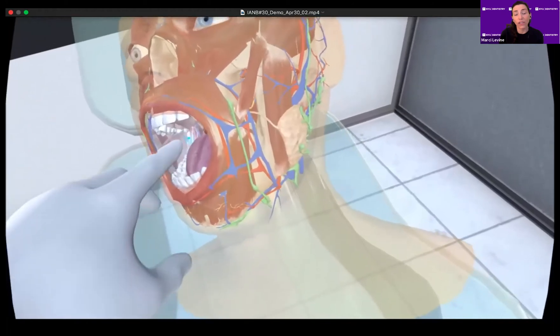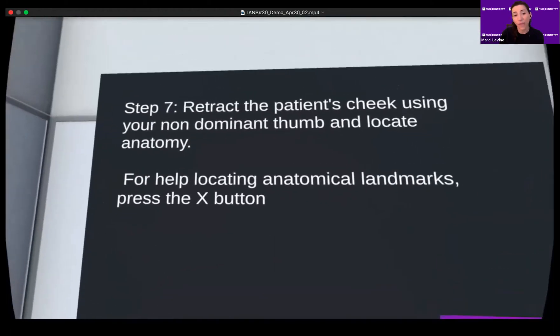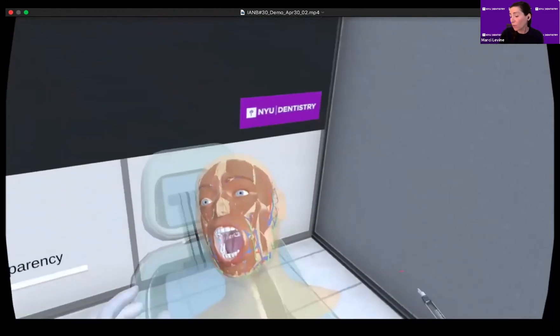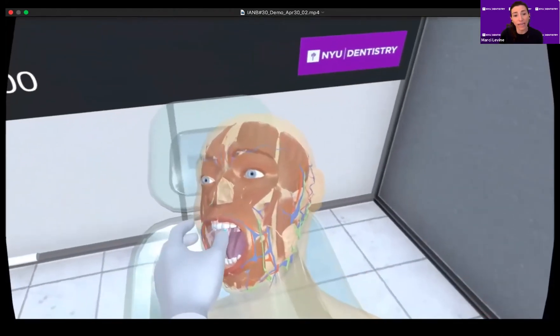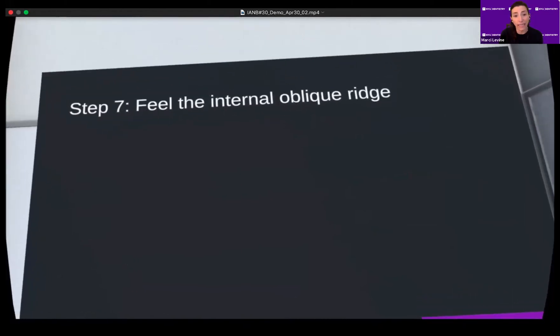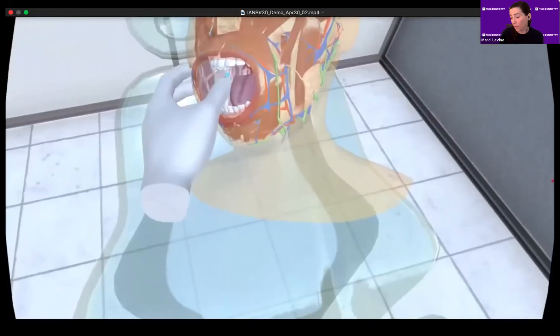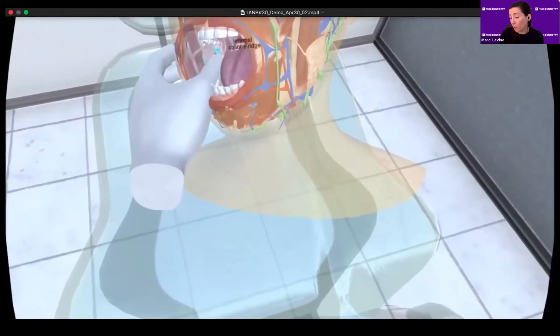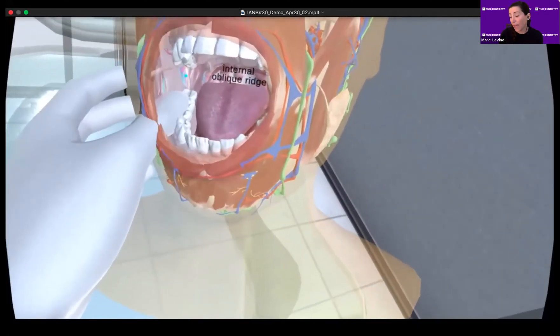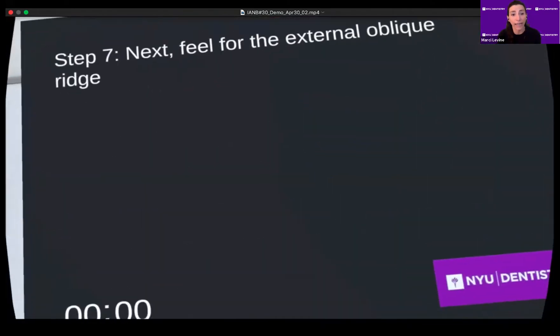Here you can see the student palpating with his non-dominant hand. The X button on the left controller provides students with help if needed. The controllers will be set for handedness, and this demo is for a right-handed operator. The steps come up one at a time as each one is completed, and more built-in feedback will be provided for incorrect answers.